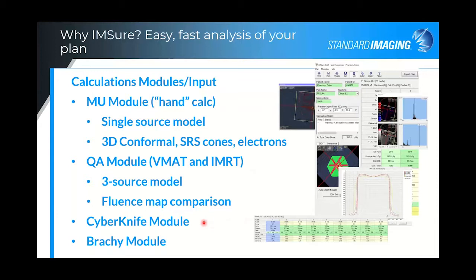The third module is a CyberKnife module, which of course is user specific for those people with CyberKnife. And then finally, the Brachytherapy module, which can be used for HDR and LDR.